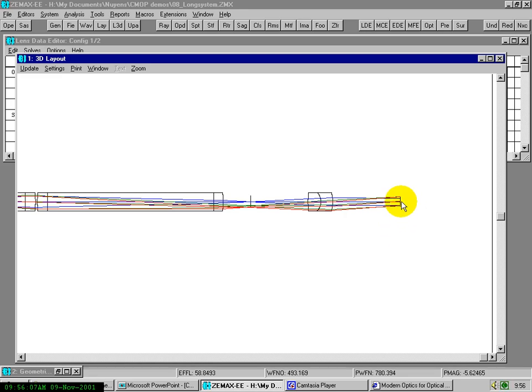And again here we see that the principal rays pass through the optical axis, so here we have again an image of the aperture stop, and obviously this is the exit pupil.